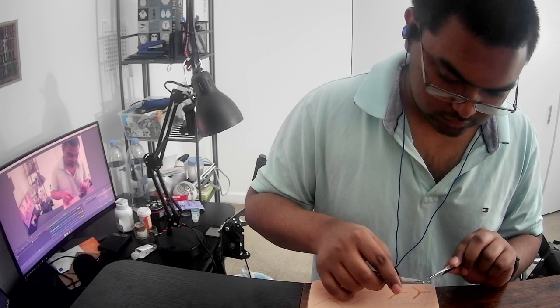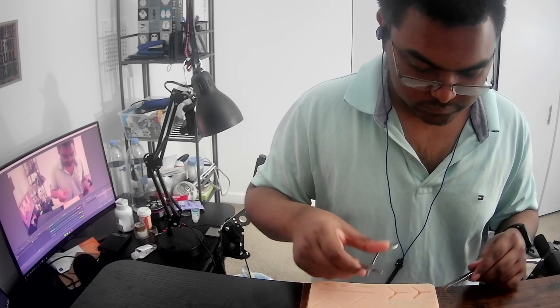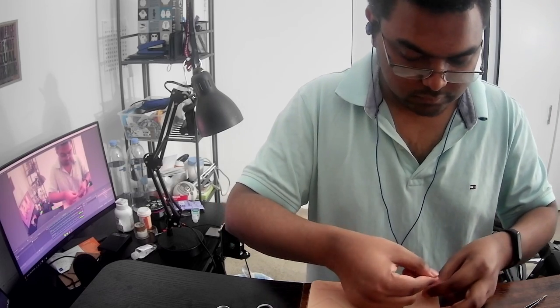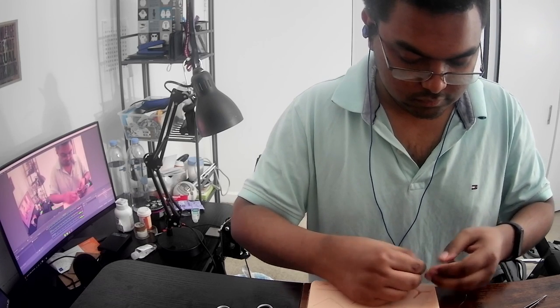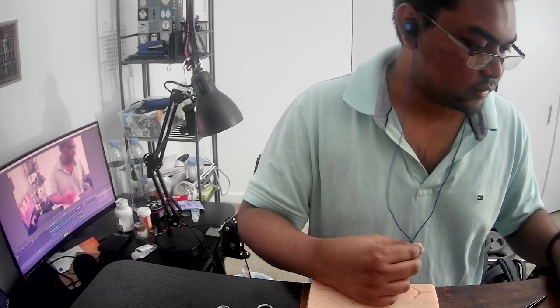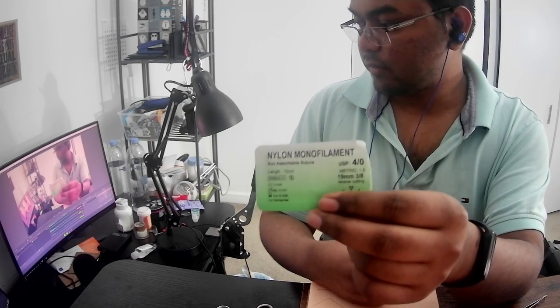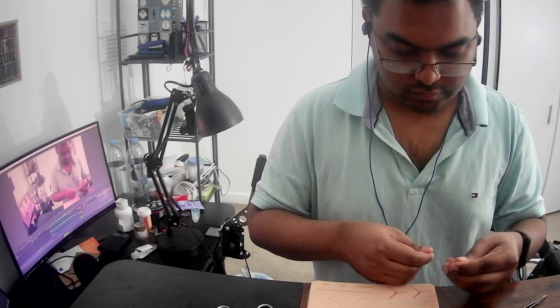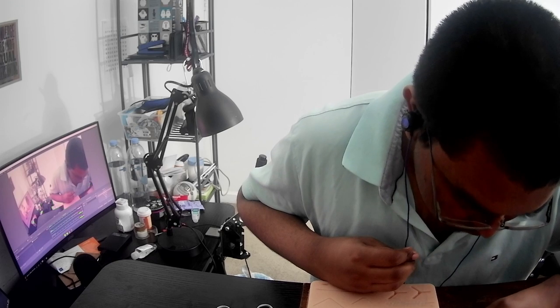So I'll unload it. Okay, I'm definitely getting better at the basics at least. So that's something. I think for these I can use my hands. Okay. Oh, it's slippery. Holy shit, it's slippery. I think it's a nylon monofilament, the one I'm using today. I have a whole pack of different kinds. And I guess I gotta eventually learn when to optimize and use which. You know? Interesting stuff.